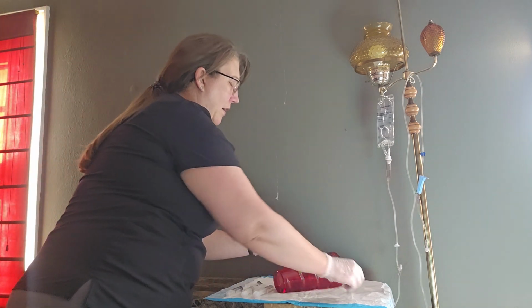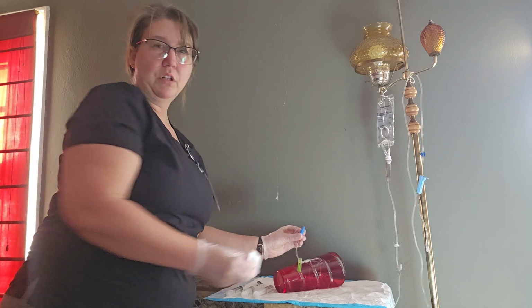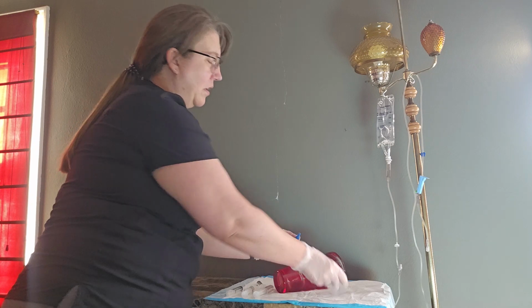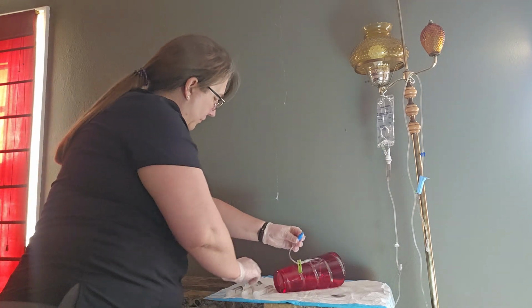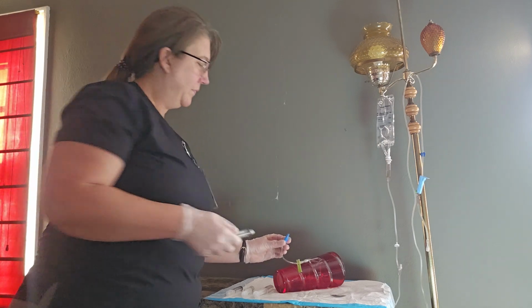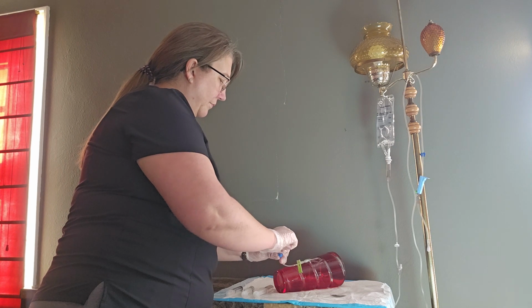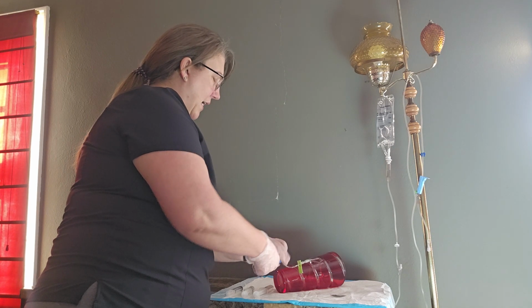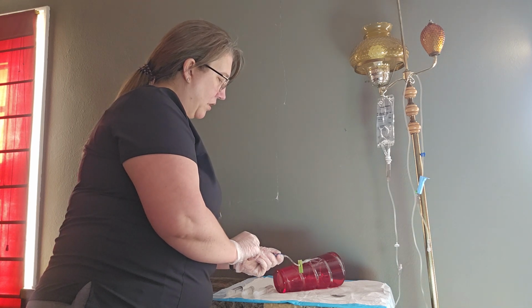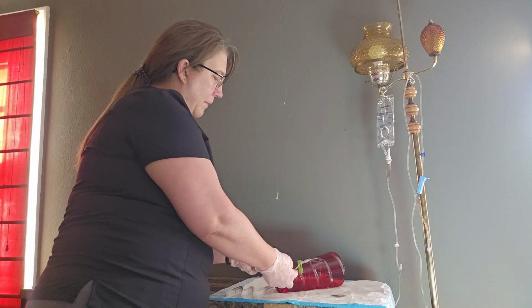Okay. And what I want to do first is get an antiseptic pad and scrub that hub. I want to allow it to dry. And first, I need to flush, so I'm going to grab my saline. After it has dried, I'm going to attach it and aspirate the syringe. So I'm going to pull back until I see blood in my J-loop.